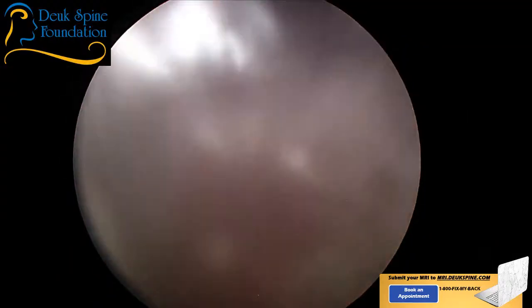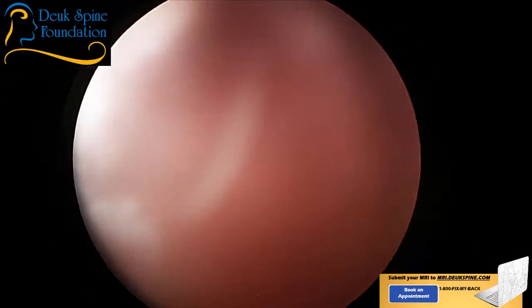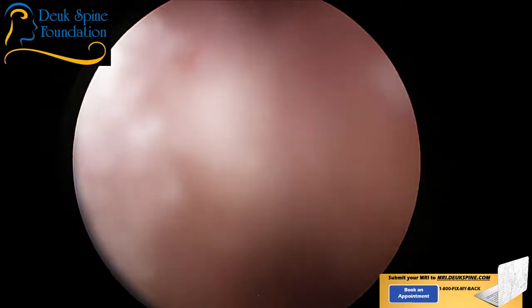This is the herniation, by the way, at this level. It's not blue because we didn't get any dye in here, but it's white, like most herniations are, kind of a beige, off-white.